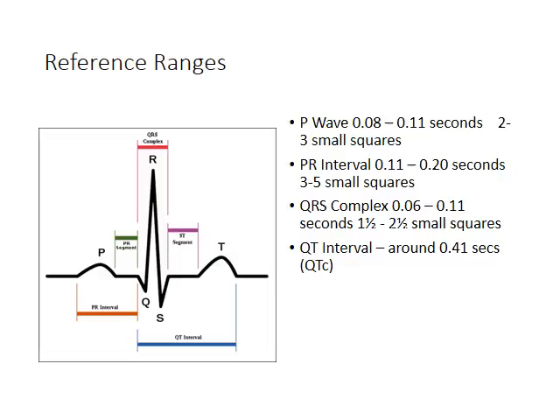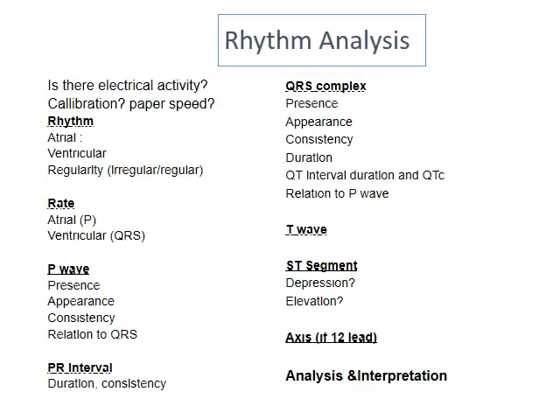Hopefully you have a piece of paper now which is similar to this slide. This is the system we would like you to use to approach the assessment of the ECG and to use in practice. The following slides will break down the sections further.